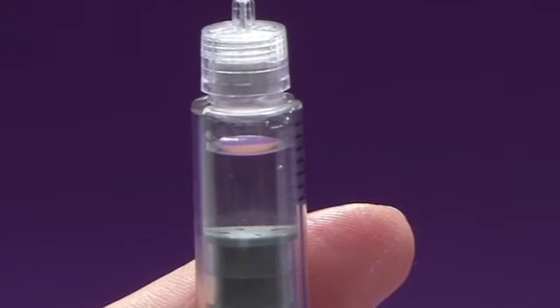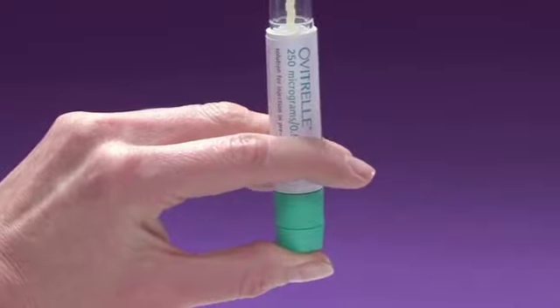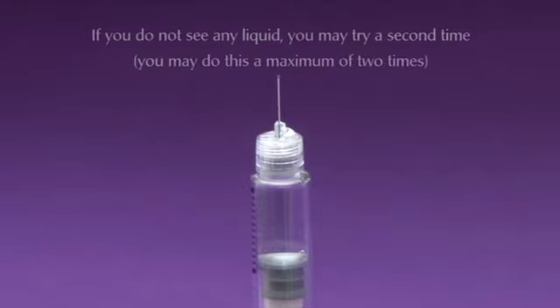Keeping the needle pointing upwards, push the dose setting knob in completely. A small drop of liquid should appear at the needle tip. This means that the large bubbles have been removed and the pen is ready to use.